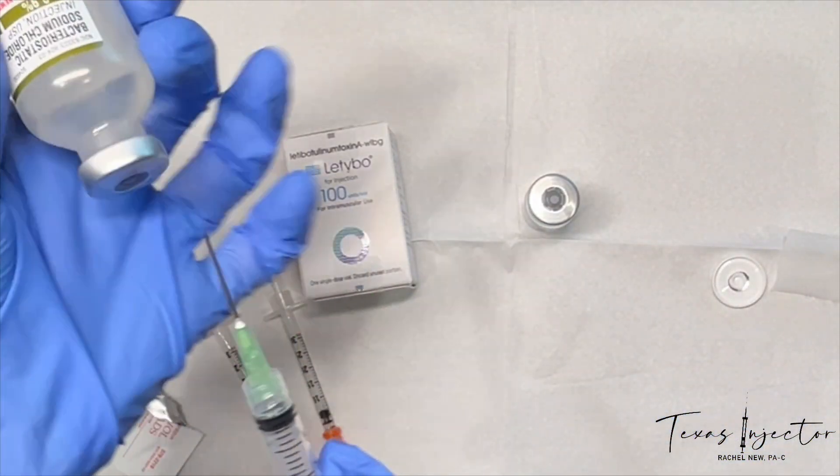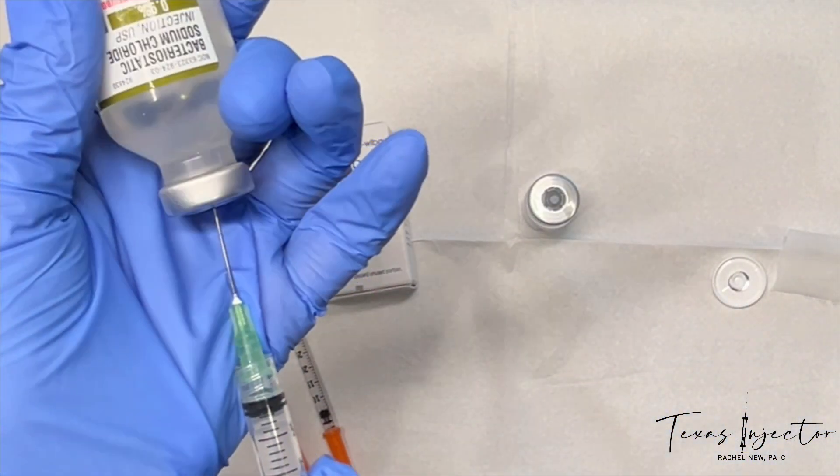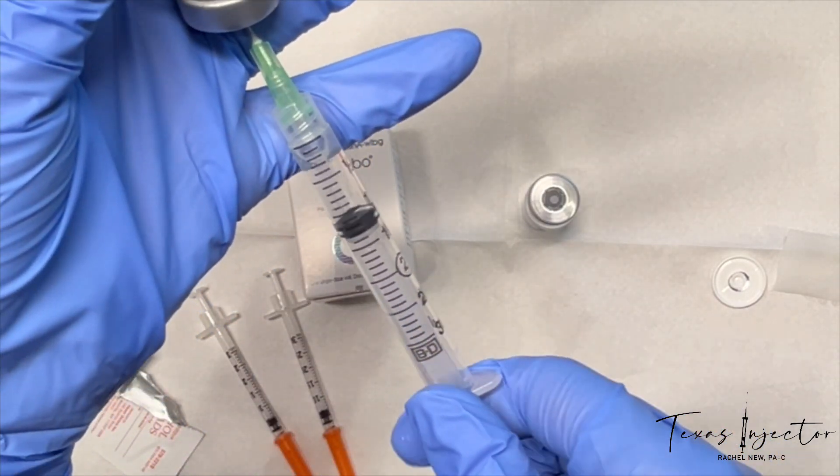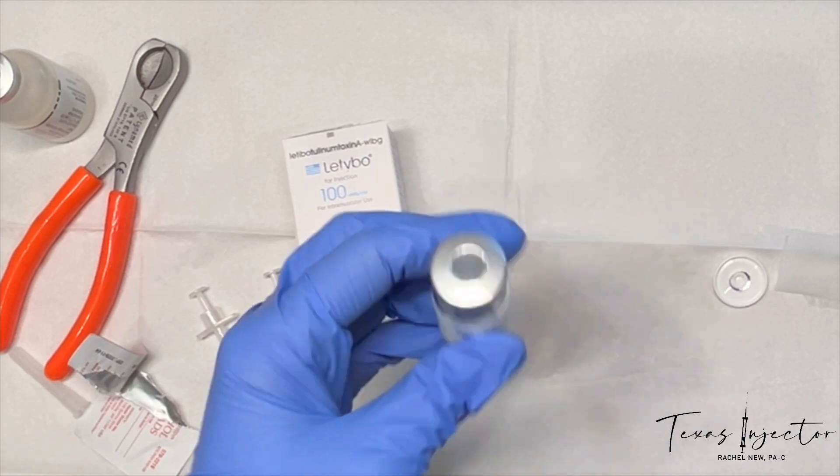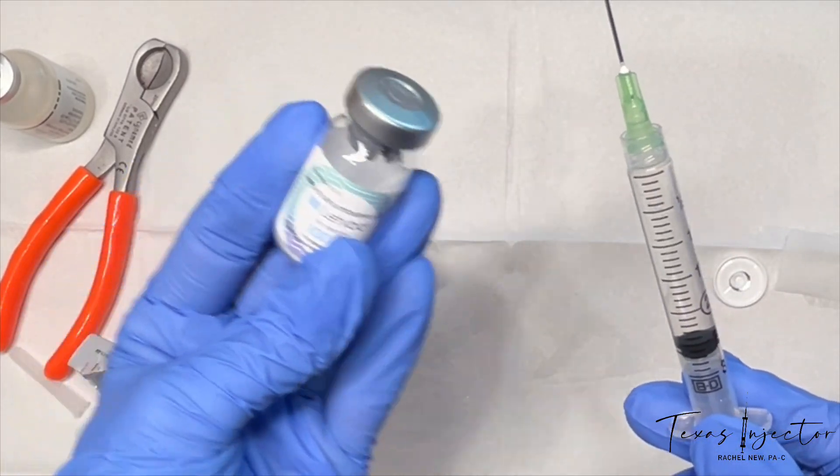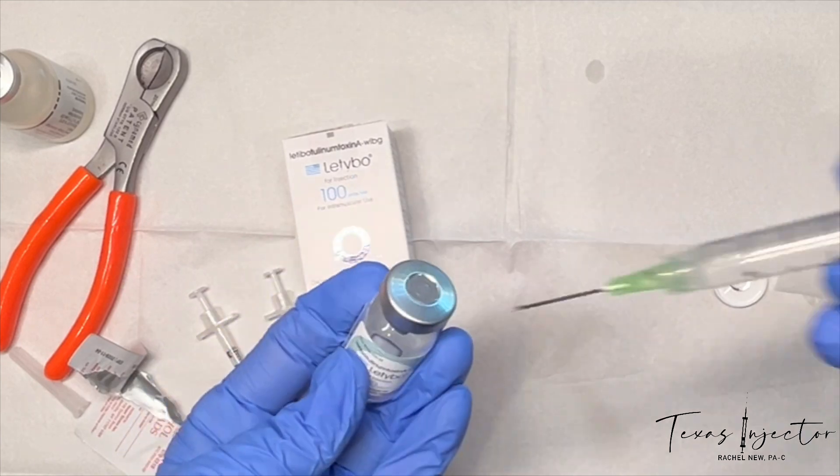We're going to draw 2.5 ml. We're then going to inject the 2.5 ml into the Latibo 100-unit vial.